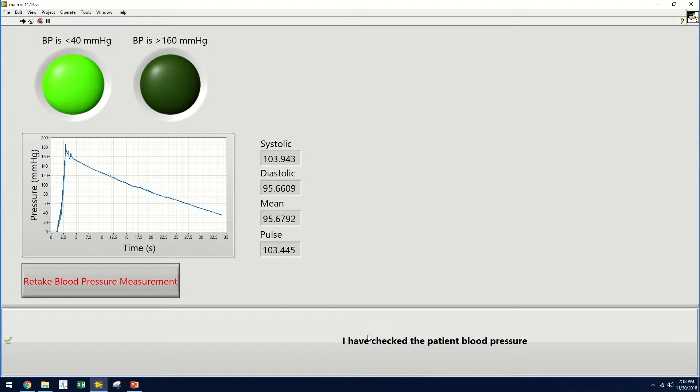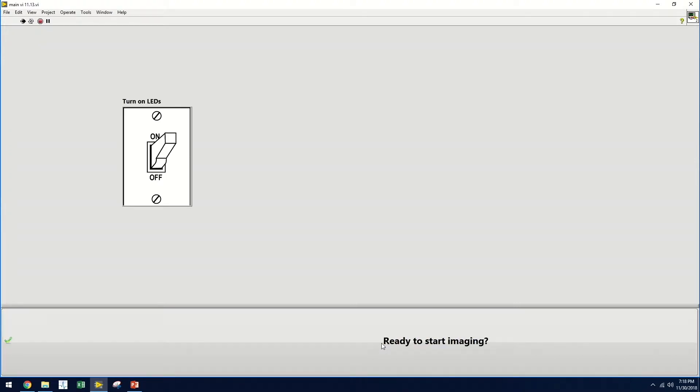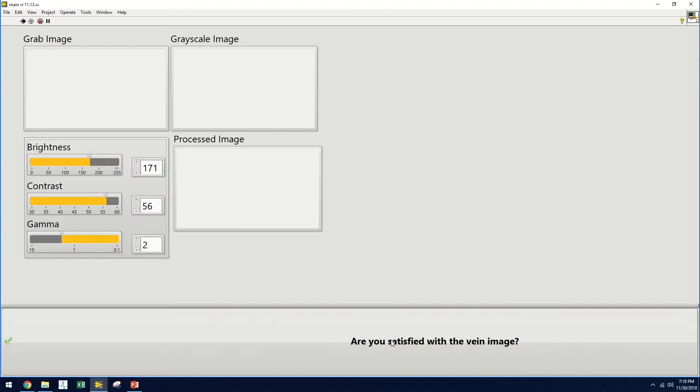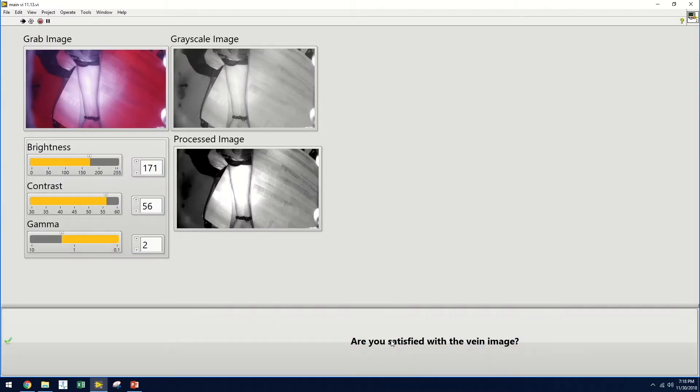If the user is satisfied with this data, they can select that they have checked the patient's blood pressure. They are then prompted to turn on the LEDs associated with the device and to position the patient arm correctly. Now they can begin imaging.